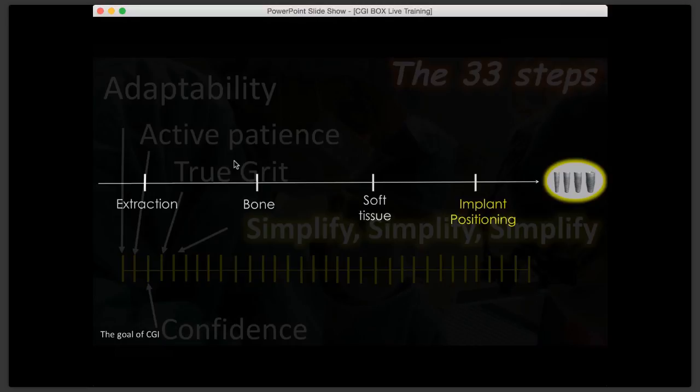They say it has surgical precision, but implant surgery is not precise at all if you do it freehand, because you're relying on your patient that is moving, and you're relying on your 3D perception of drilling in the right trajectory.